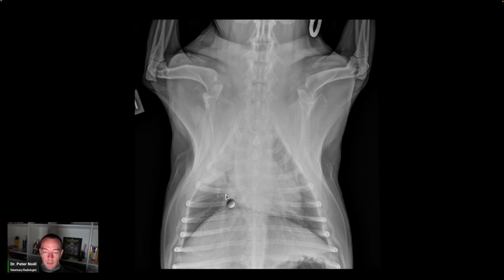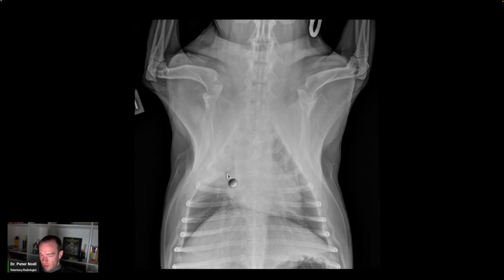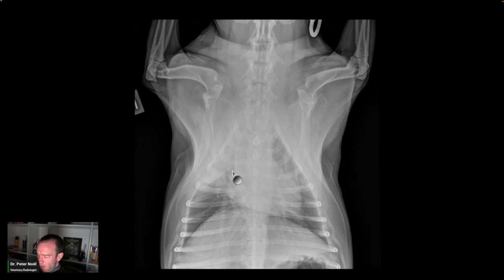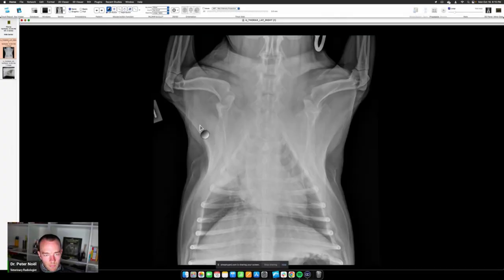If we had the left lateral view, maybe you'd see an air bronchogram, but you don't always see it because if the air bronchogram fills with pus, it just obscures it and you get a whiteout. In this case, this is an alveolar pattern — pneumonia. Next differential would be pneumonia, and then hemorrhage. In Southern California you'd also consider migrating foreign objects like foxtails.